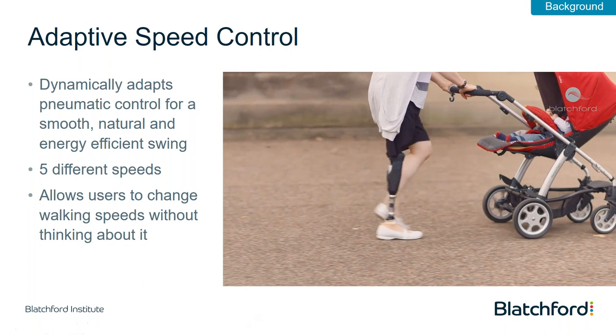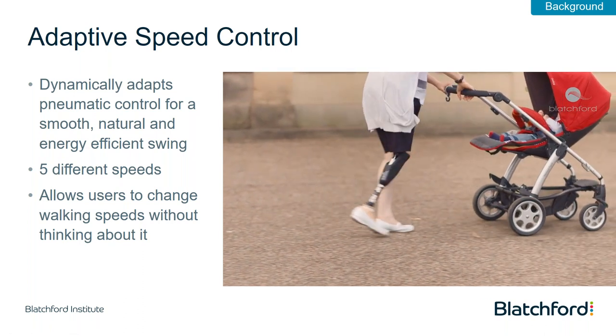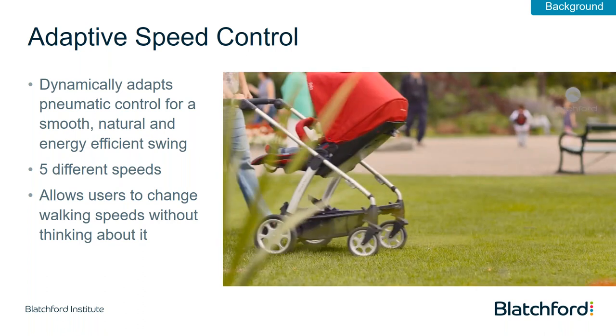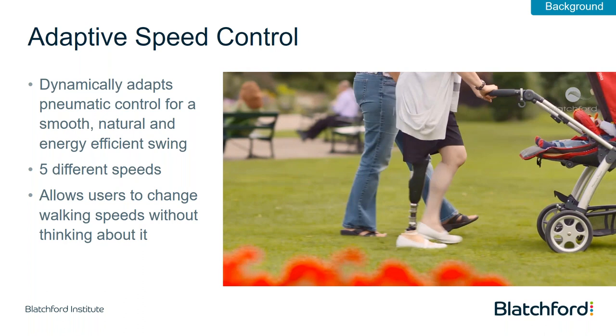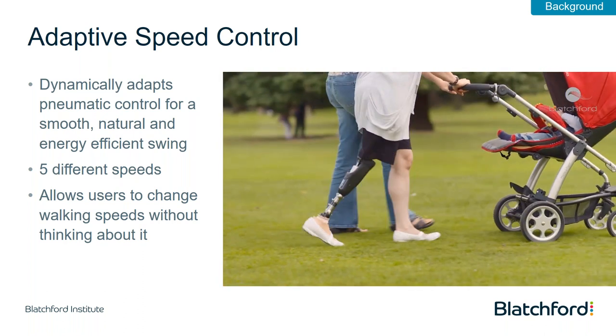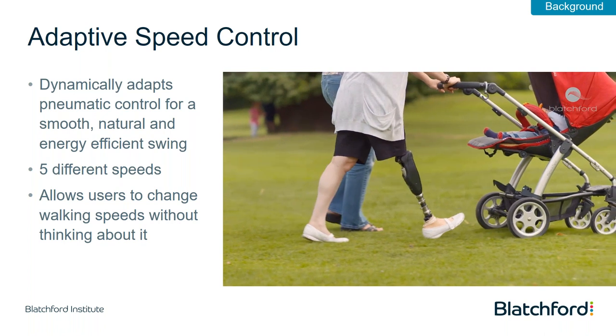at the leg, okay, so the degree of flexion you get will change depending on the walking speed of the amputee to give you something that matches the sound limb and the heel rise in the sound limb with different speeds, keeping it as natural as possible.